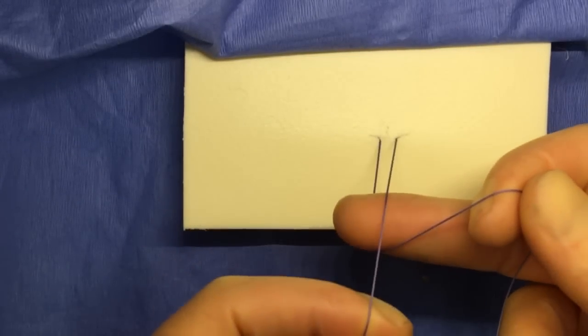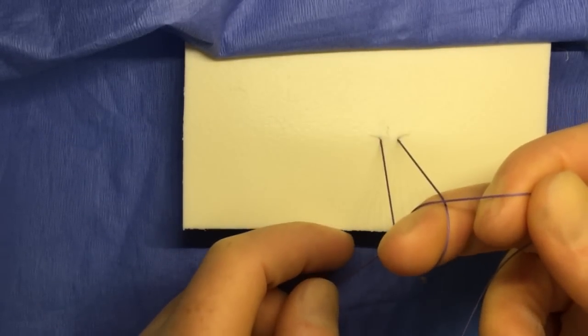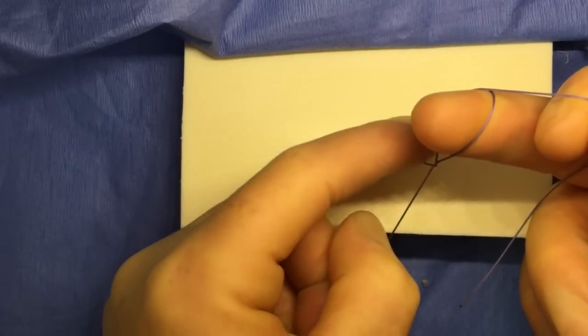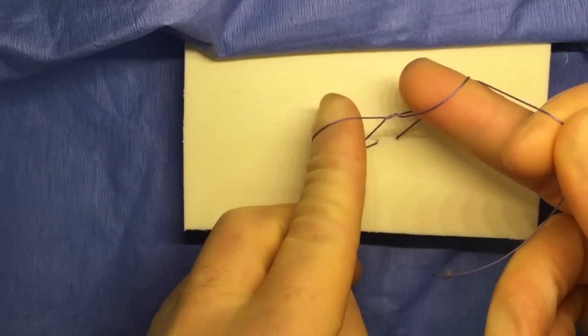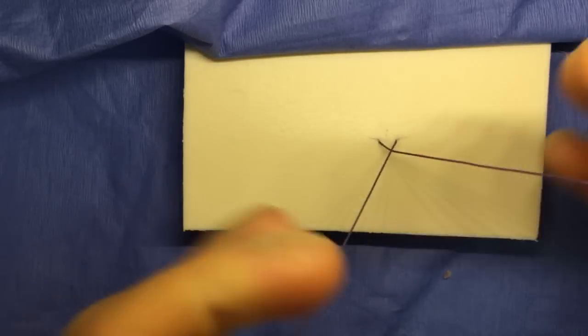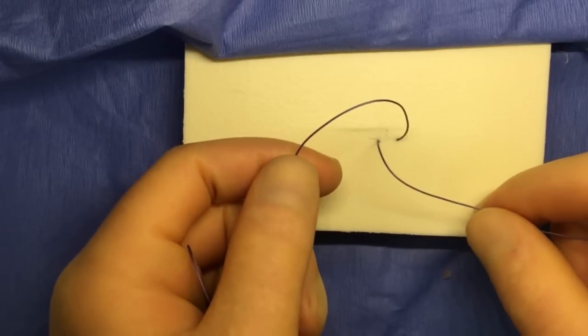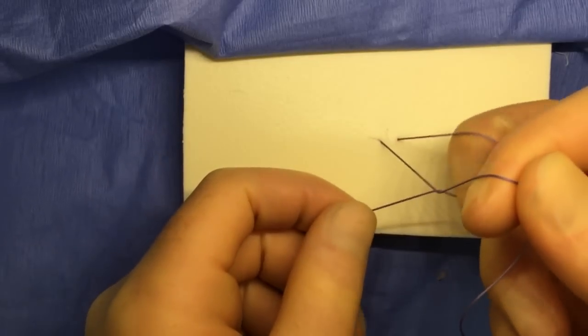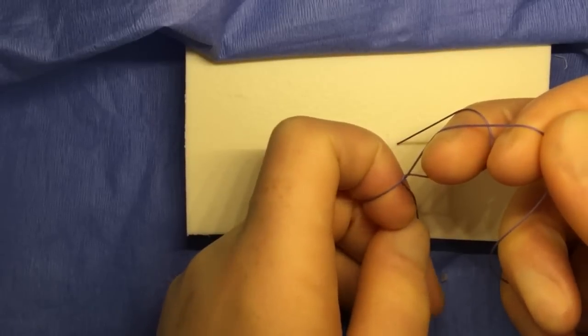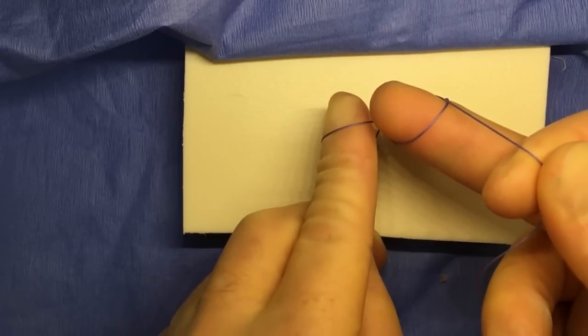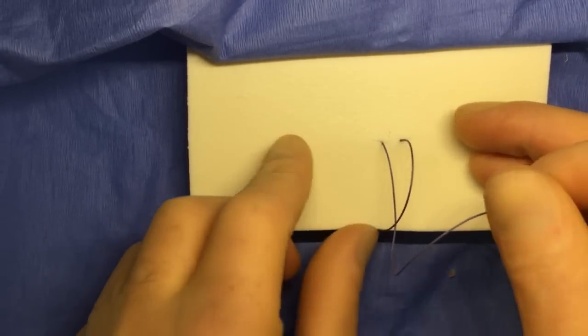A little more quickly: it's a one-handed knot towards yourself with the right hand, and a one-handed knot away from yourself with the left hand. Again, one-handed knot with the right hand backwards, and a forehand left-handed knot with the left hand.